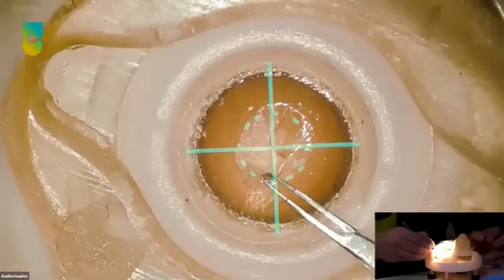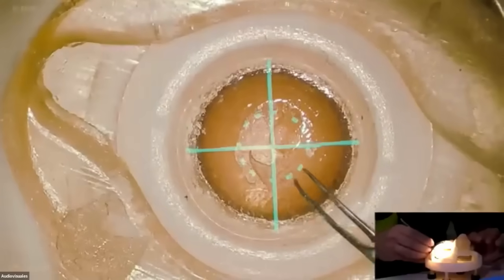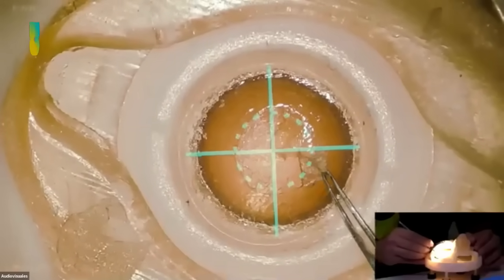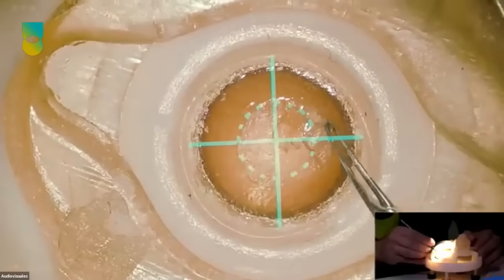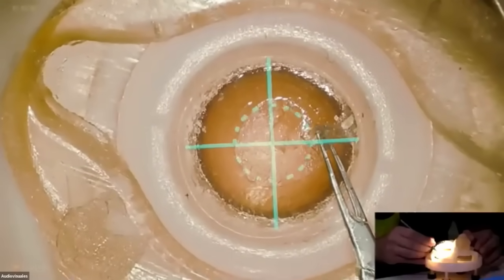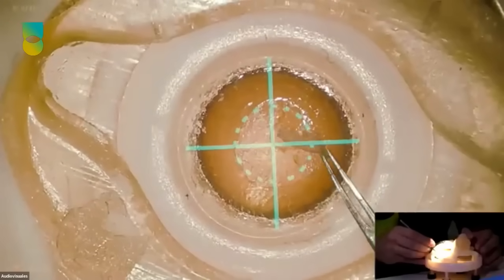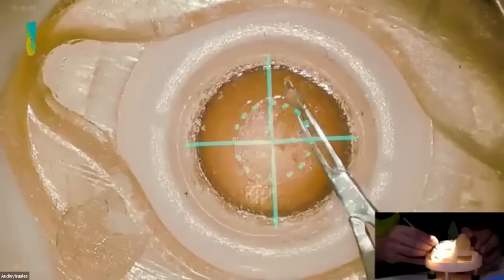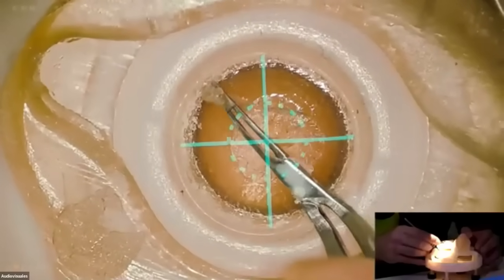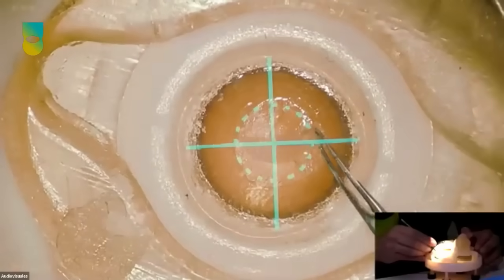Okay, we are adding something, a very important tool. We're using technology. This is when we have some colleagues that want to put in a multifocal and want to do a perfect capsulorhexis, but in this case we are using augmented reality, so the resident can understand and especially have a guide about the size and the location and the shape of the capsulorhexis. I think this is very important. Ashley, we see you all the time with amazing technology there at Cornell doing surgery. Do you think this is something good to teach?